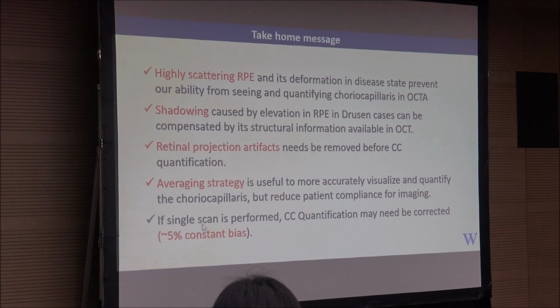If you just want to do a single scan for the quantification, you have to compensate for this bias. With a single scan, there is about 5% bias that you need to compensate.